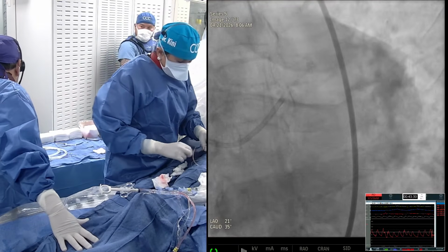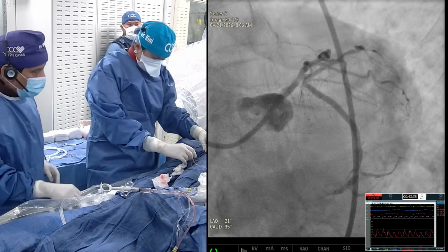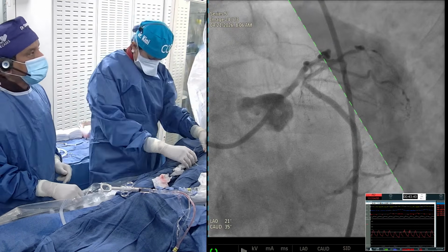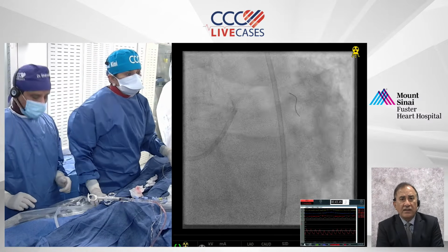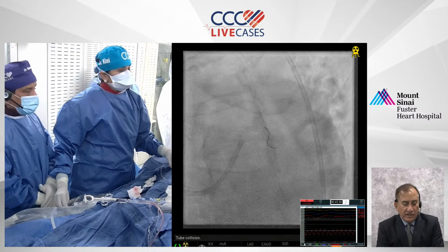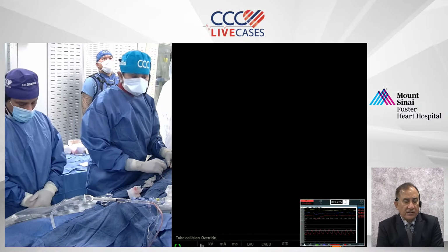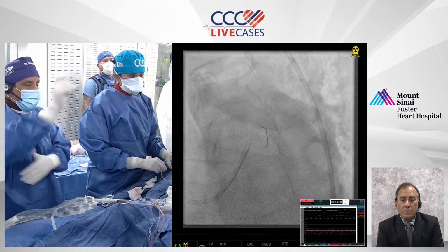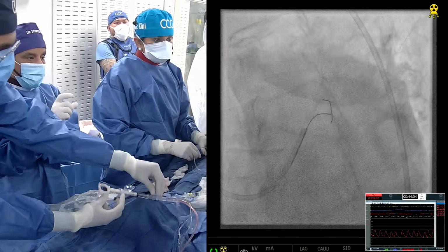Go back with the Caudal. Let me see if I can do it. With this circ wire? With the Runthrough wire. Okay. As in several bifurcation, trifurcation cases, POT is critical. I think in this case, it will be of extreme importance to get it exactly right, perfectly positioned so that it is not too distal either. And that is the importance when we are talking about POT: make sure there is enough stent length in the main vessel, because otherwise it will be an issue.